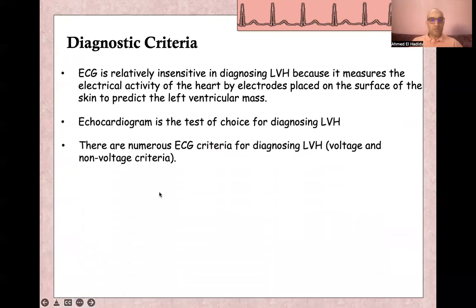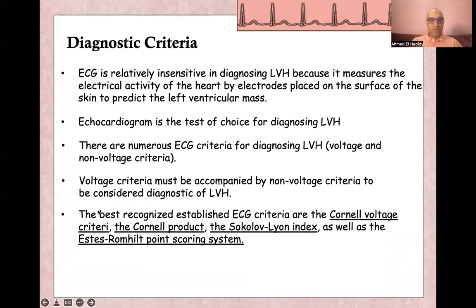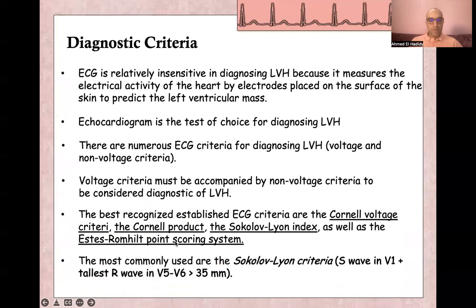There are many ECG criteria for diagnosing LVH, including voltage criteria and non-voltage criteria. It is best to see voltage criteria accompanied by non-voltage criteria to consider a diagnosis of LVH. Many voltage criteria exist, such as the Cornell voltage criteria, Cornell product, Sokolow-Lyon index, and Romhilt-Estes point scoring system. The most commonly used is the Sokolow-Lyon criteria: S-wave in V1 plus R-wave in V5 or V6 greater than 35 millimeters.